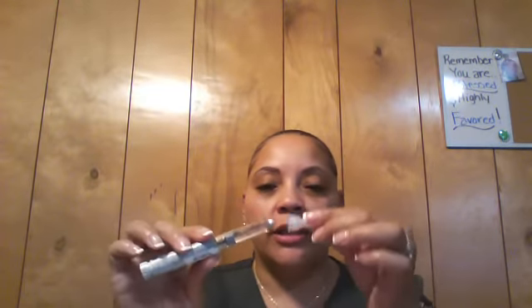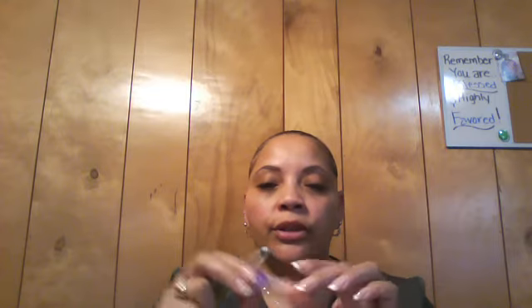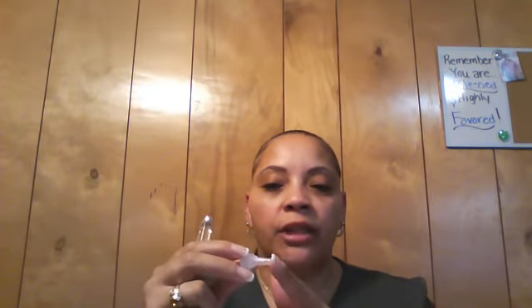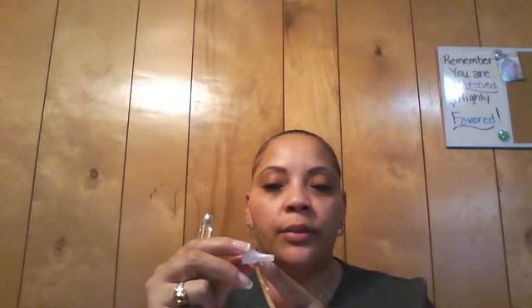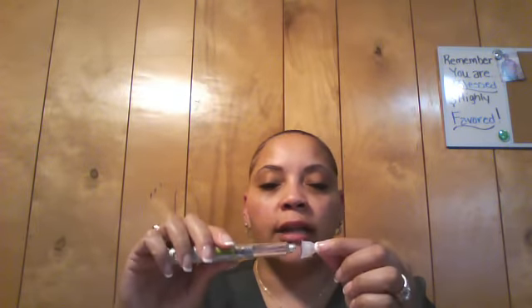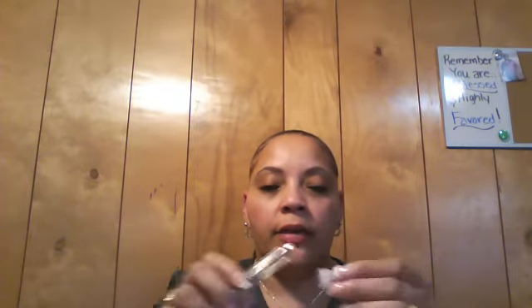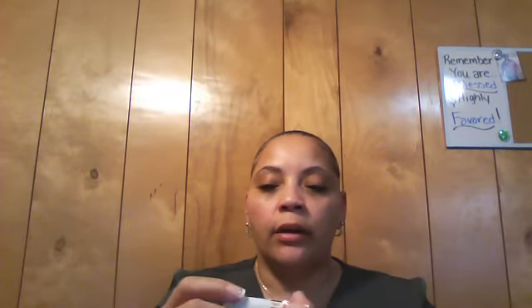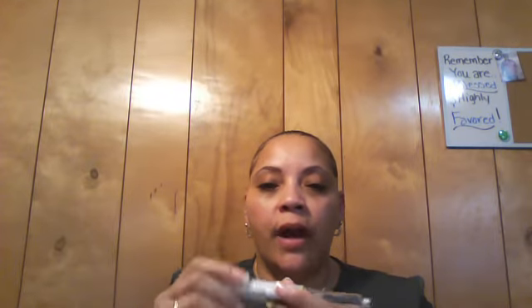I will attach this needle, which opens, and it has a cap, and then it has a protective cap and then a protective needle shield. So I will screw this attachment on. And then this is attached and screwed on. I would then dial up 5 units of insulin on my insulin pen.